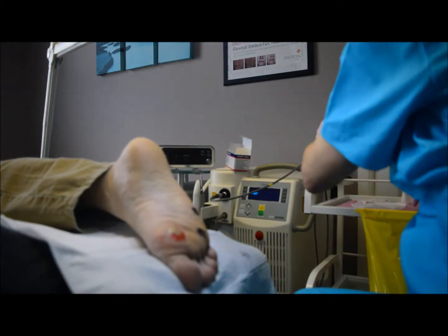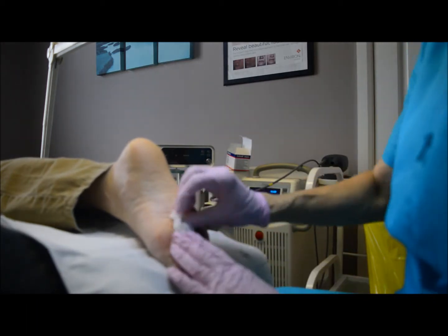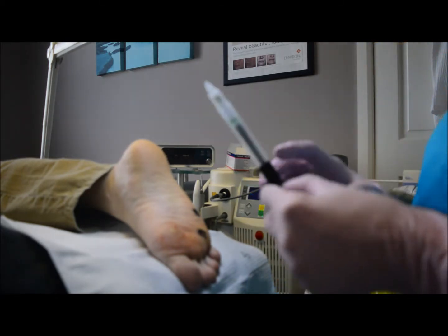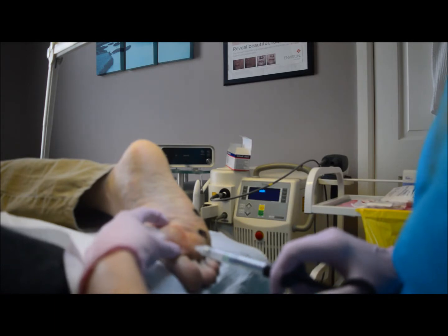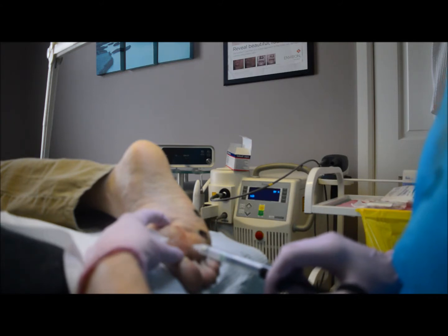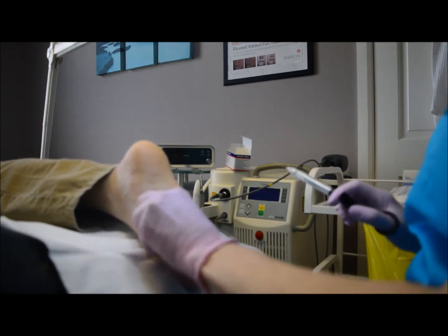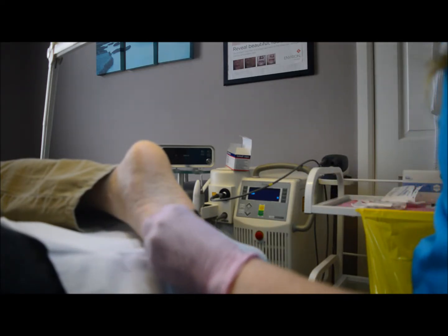Now we're going to take the device away and demonstrate the difference by trying to anesthetize the other side of the foot without it. I want feedback — don't hold back. Yeah, how is that? Okay, I'm going to come out because I've only just put the needle in there and that's uncomfortable. We all have a different perception of pain, but if a patient is that uncomfortable it's time to stop.